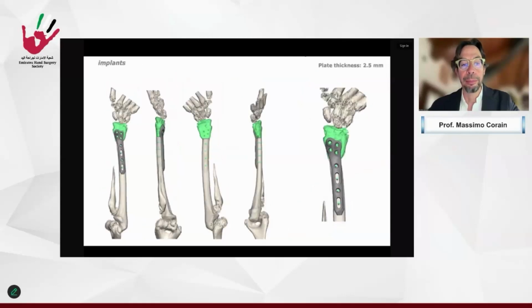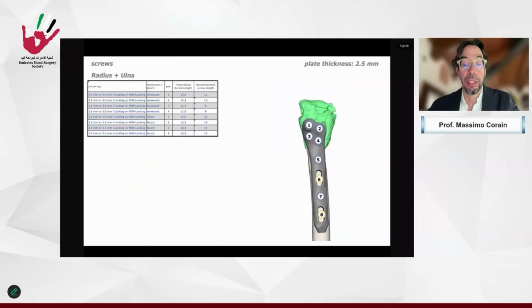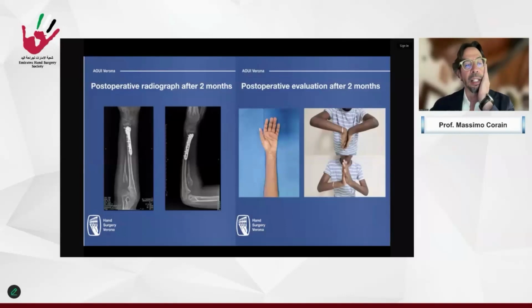And the plate, in all these cases, I have the perfect length of every screw. So I only have to ask, give me the 1, the 2, the 3, the 4, and the length is already decided before surgery. This is the radiological post-op aspect and the clinical aspect during the follow-up with a good straight alignment of the wrist and a maintenance of the flexion extension of the wrist.